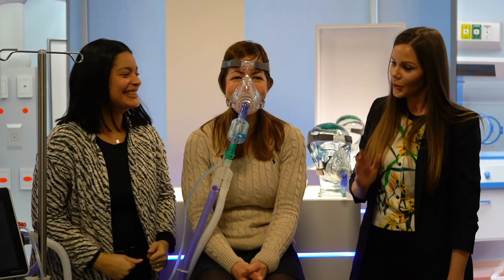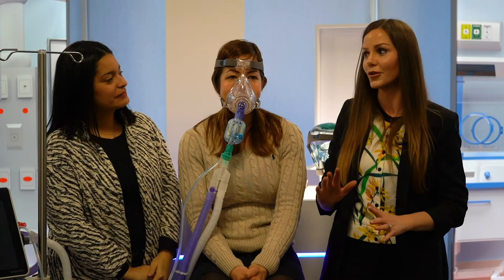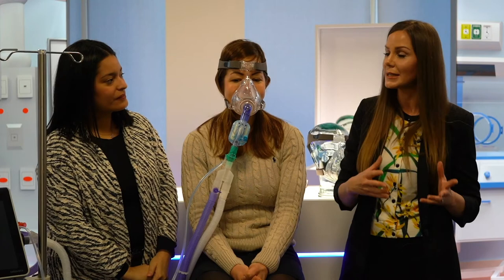Now the Bella Vista Vyaire is for another day, okay? But what I would do, I would turn it on. I would set my PEEP, my positive end expiratory pressure, the pressure we don't want it to fall below, and I would set my inspiratory pressure, which is the push that we want to give this patient when they're breathing in, to do that work of breathing for them, because remember, they've got that respiratory failure. And the last thing I would set would be my FiO2, which is my fraction of inspired oxygen, and that's the percent of oxygen I want to deliver to this patient. Now that's Bella Vista in simple terms. It's a lot more complex than that. But those are the settings.